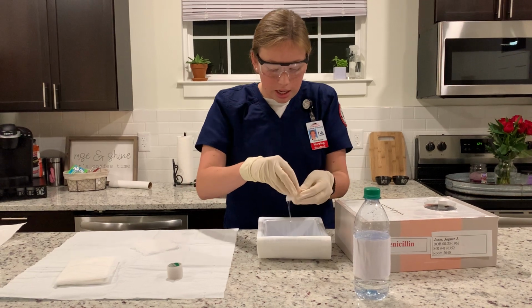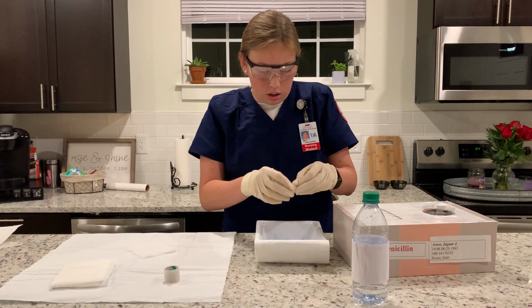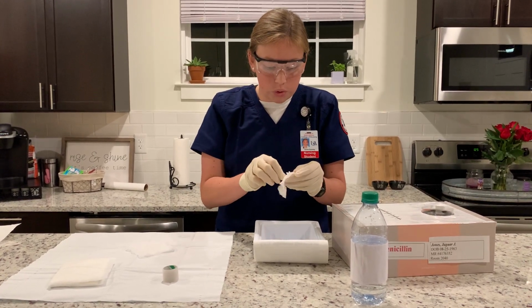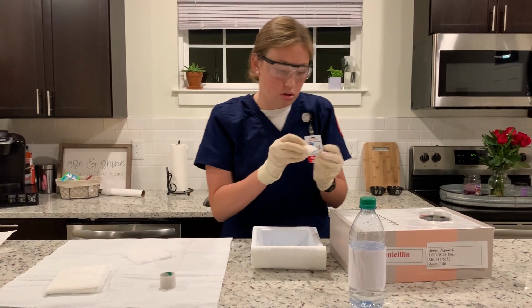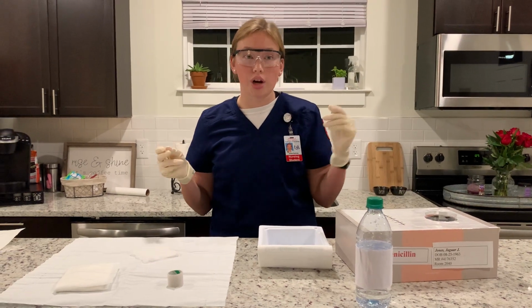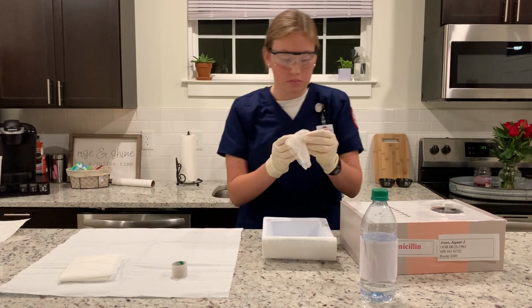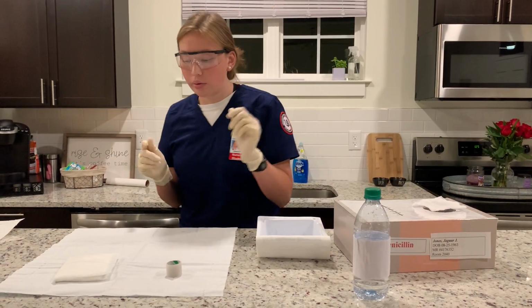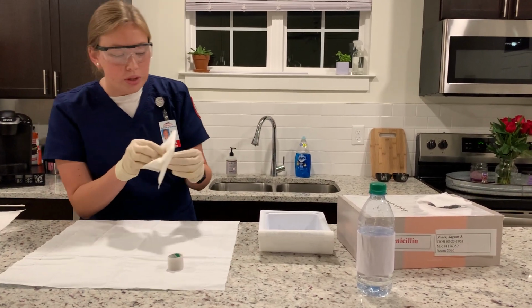I'm going to do it one more time. Trying to fluff some more. And then place it in there as well. So now I will take a dry 4x4 and place it over the top of the wound. And then now I will take the ABD pad and place it on top of the open wound with the blue line up.